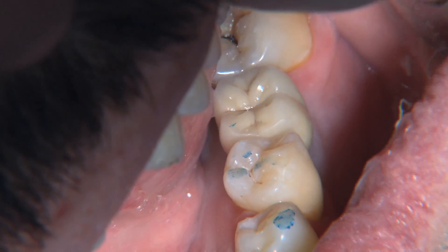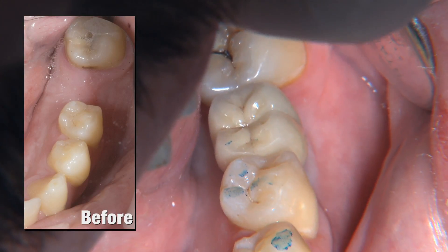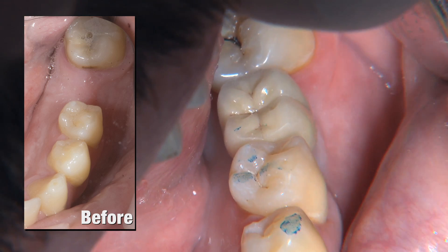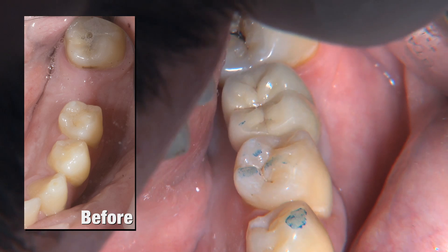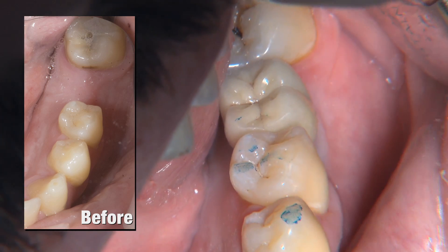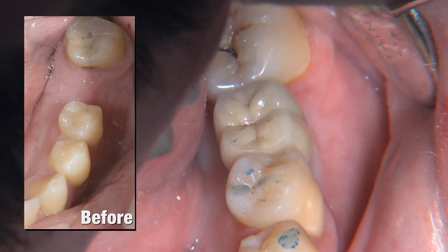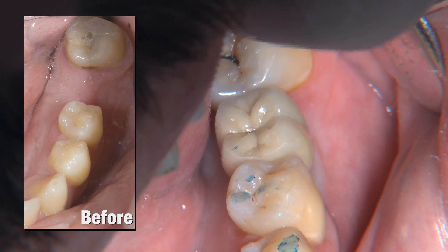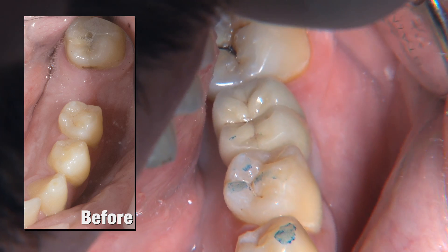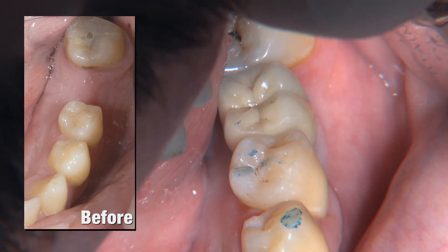The crown blends in pretty nicely — a great result for this patient. Twenty years ago when I got out of dental school, the only solutions were a partial denture, doing nothing, or most commonly a three-unit bridge where both adjacent teeth would have been prepped for full crowns. The placement of an implant with a single unit crown is a very elegant solution to this problem.